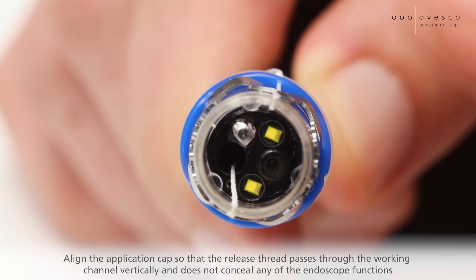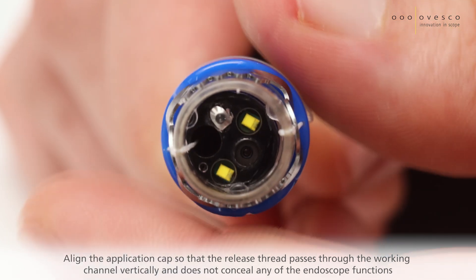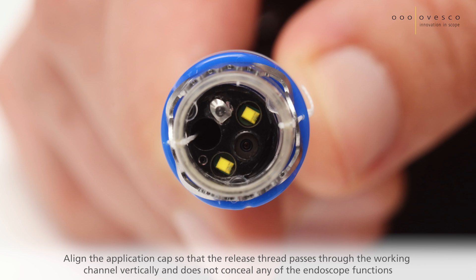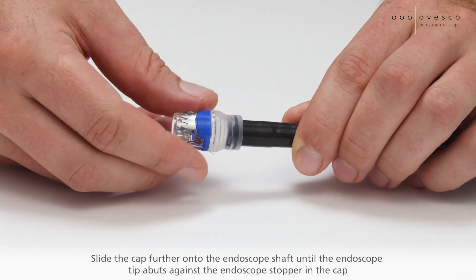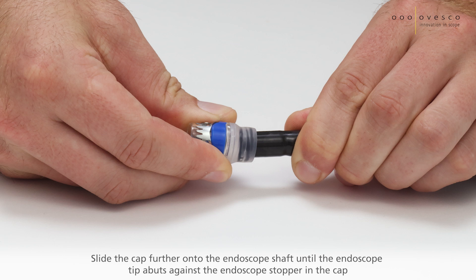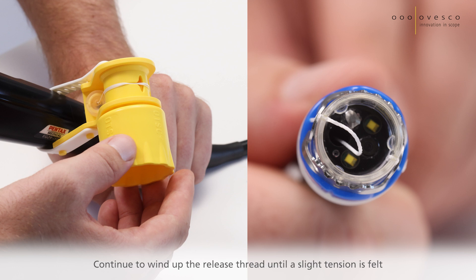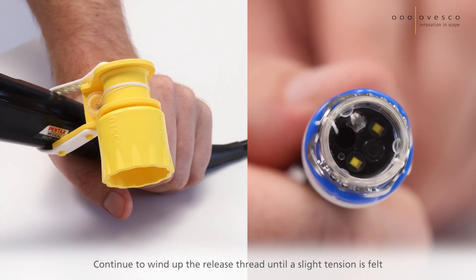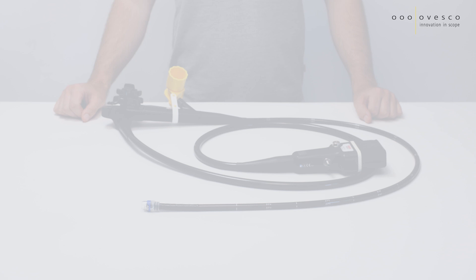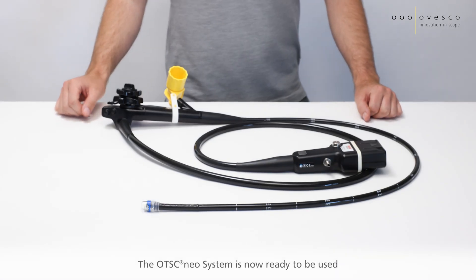Align the application cap so that the release thread passes through the working channel vertically and does not conceal any of the endoscope functions. Slide the cap further onto the endoscope shaft until the endoscope tip abuts against the endoscope stopper in the cap. Continue to wind up the release thread until a slight tension is felt. The OTSC NEO system is now ready to be used.